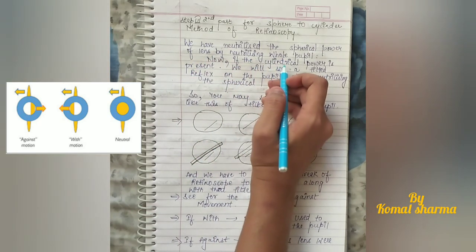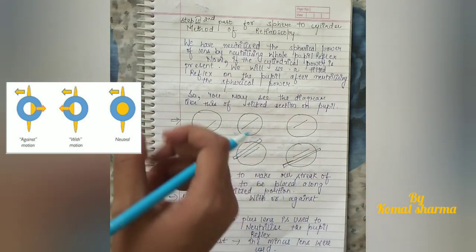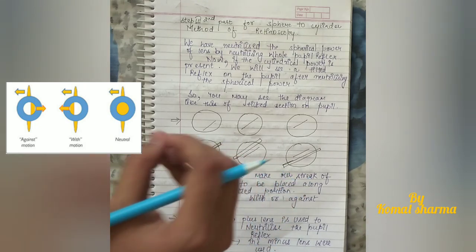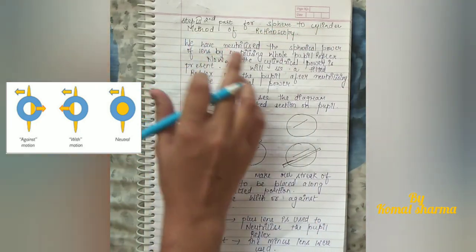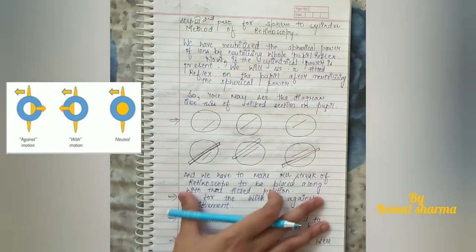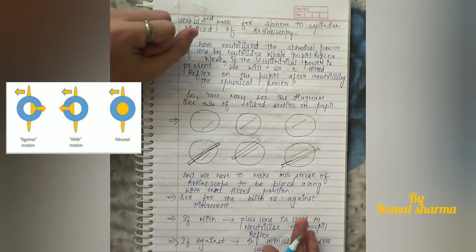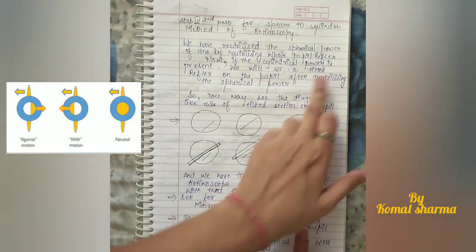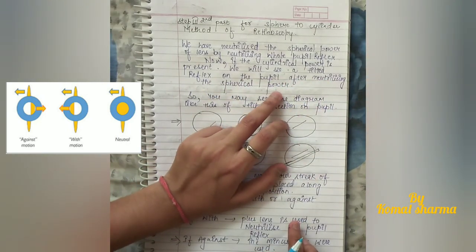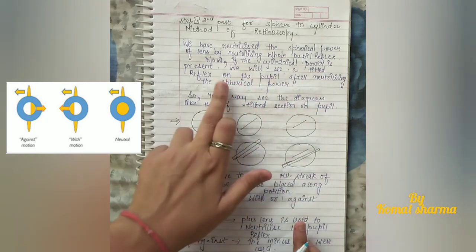In the second part of step three for the sphere-to-cylinder method, we neutralize the spherical power by neutralizing the whole pupil reflex. We observe the pupillary reflex and neutralize it with a spherical power lens — a complete neutralization of the pupillary reflex. If cylindrical power is present — pay attention — after neutralizing the spherical power, we will see a tilted reflex on the pupil.